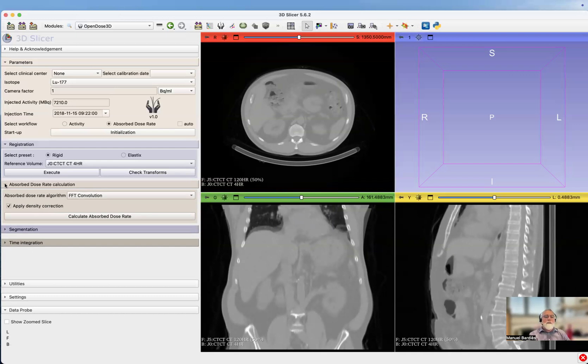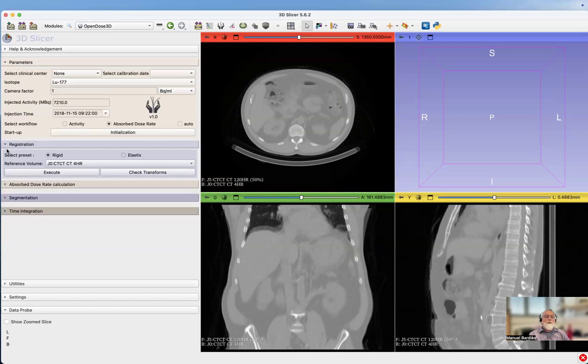That is very, very fast. It's applied with density correction, done by default. What I've been doing here is doing the absorbed dose calculation at every time point.